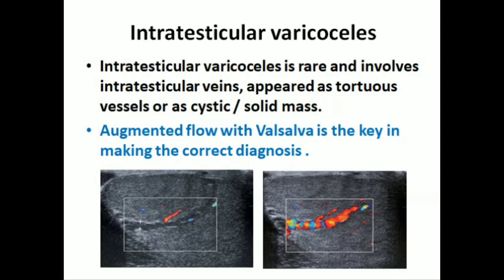Another variant is intratesticular varicocele. Intratesticular varicoceles are rare and involve intratesticular veins. They appear as tortuous vessels or a cystic/solid mass. This image shows dilated vessels with augmented flow on Valsalva, demonstrating increased blood flow.